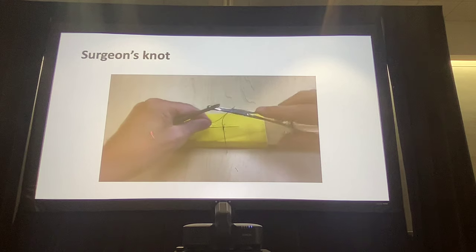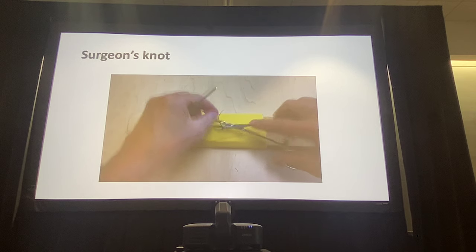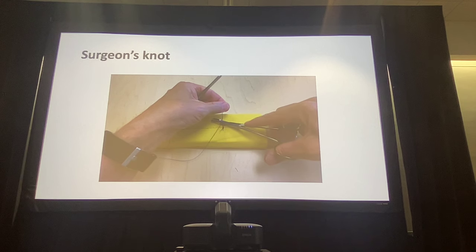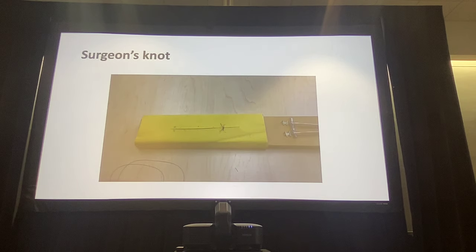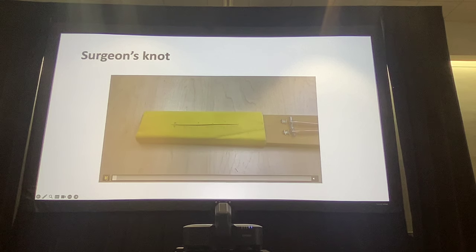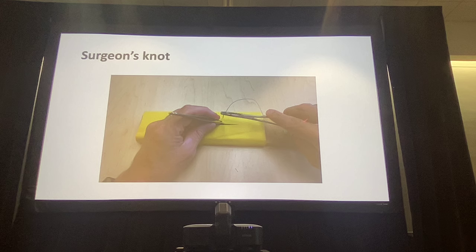So the reason why I like that these devices move all over the place is it makes you have to think, okay, how do I maneuver my suture, my needle, without making this prosthetic move so much? Because if you pay attention to that, it's going to help you in a real scenario by being aware of where your arms are in space. We get so focused on the surgery that we forget that stuff. So keep that in mind. Try to place your sutures with minimal to no movement of this entire block, if you can.